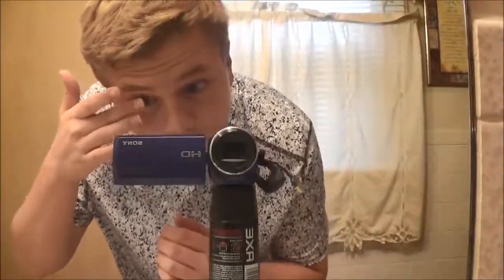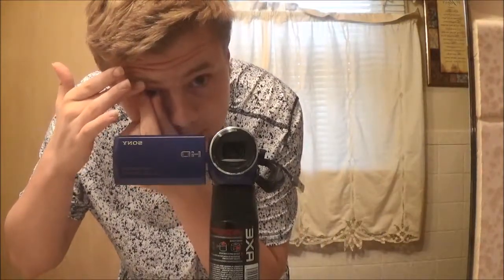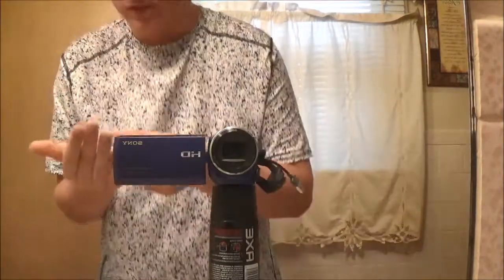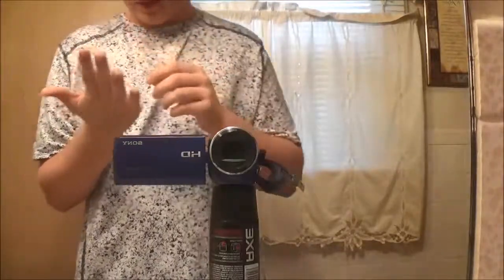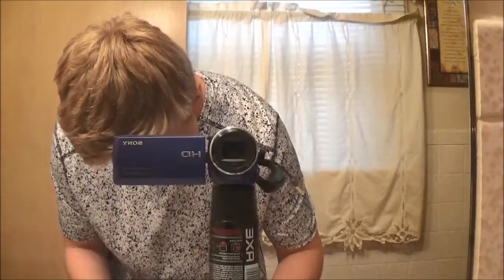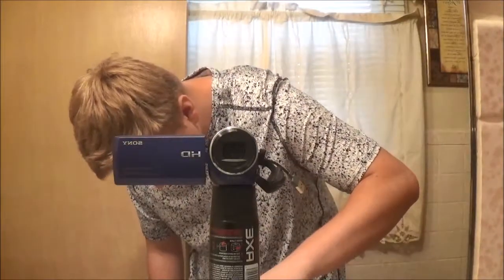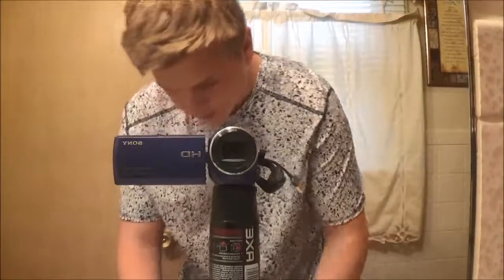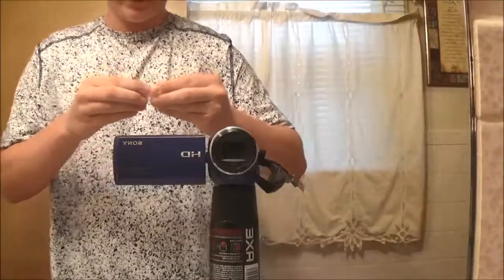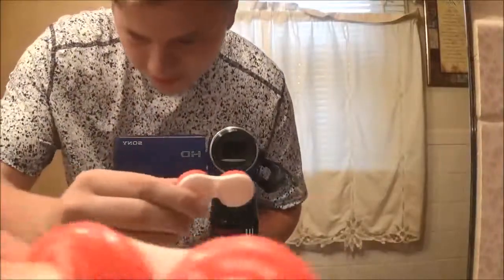And so what you're going to do is look up like that, like we did before. Each side of the color of your eye, like right here. Pinch. And now you have got the left contact in your hand. So now you're simply going to put it in the left case, right there, and fill it up until it's not too full, but just full enough. That looks pretty good, so I'm going to go ahead and cap it on there. Twist it tight, and now the left's done.